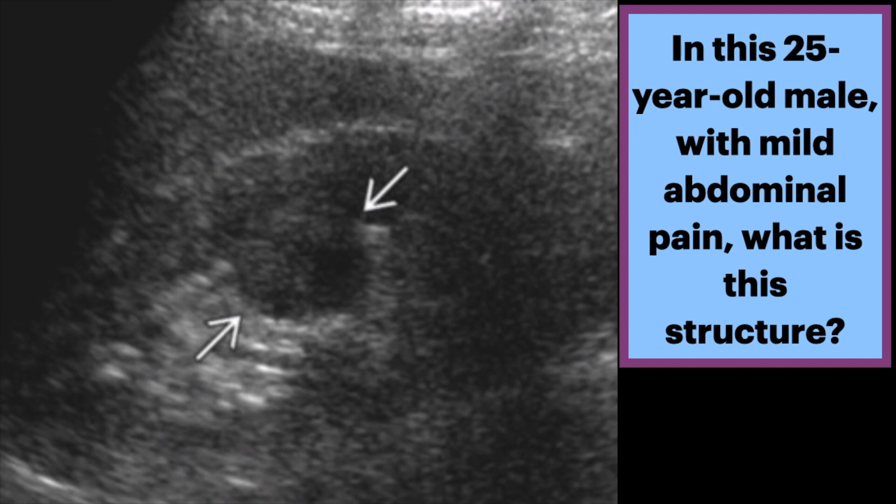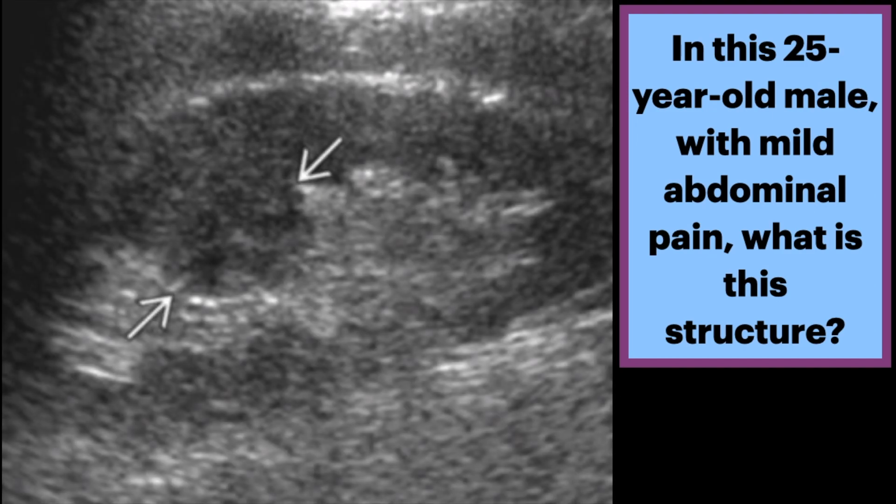Longitudinal grayscale ultrasound of the kidney shows focal cortical hyperplasia, which is isoechoic and continuous with the adjacent cortex, and indents the renal sinus.